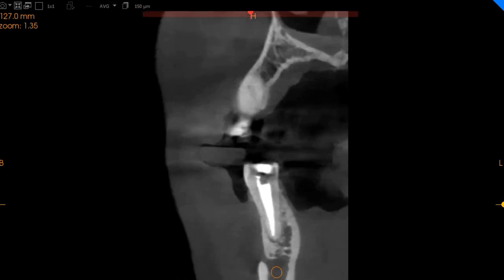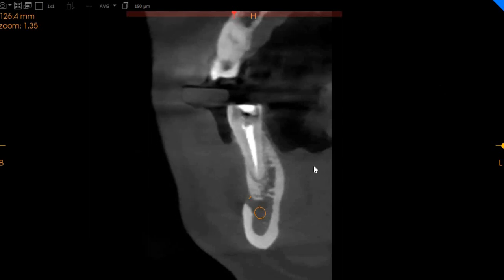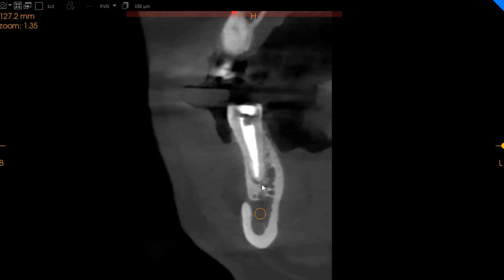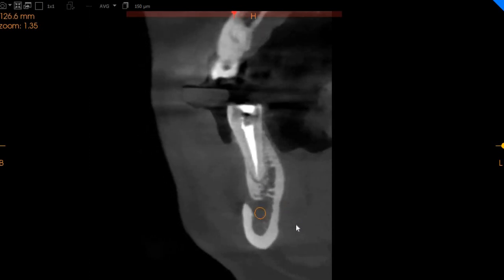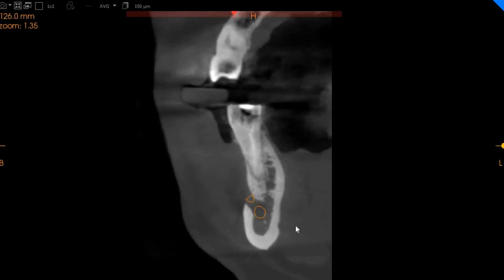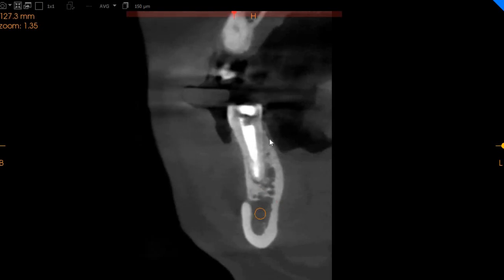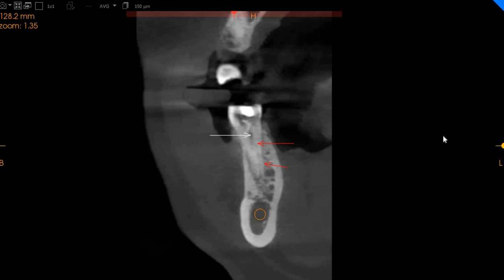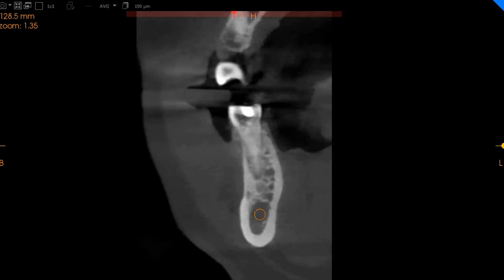The area of interest that was not seen last time was the lower left five. As you can see, endodontic treatment has been done. There is very mild PDL thickening at the apex right here, but nothing very major. No periapical radiolucencies can be observed, and we can't see any major faults. We do however feel there is a slight line here on the distal aspect, which might indicate a fractured tooth.